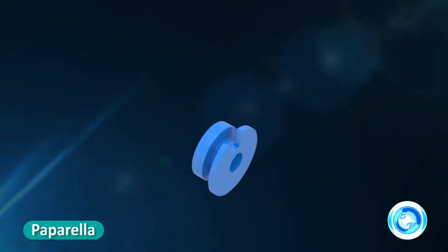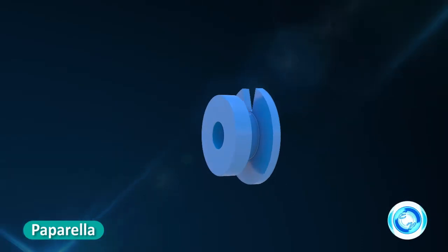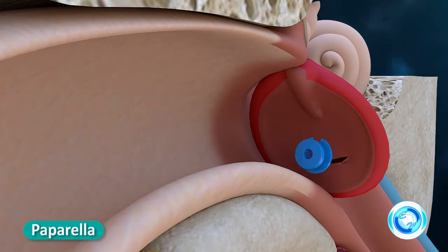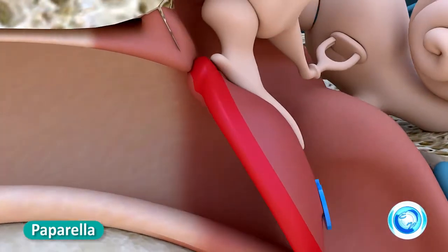Paparella tube: large inner flange with a special V-shaped notch. This provides ease of insertion in a smaller incision and prevents spontaneous extrusion of the ventilation tube. Silicone material can be compressed for easy insertion.